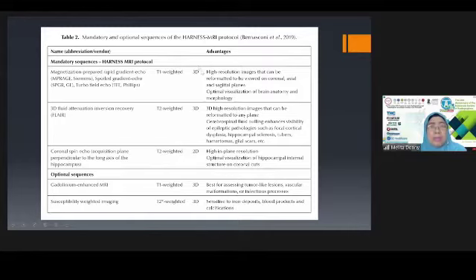Use T1 in 3D, yeah, to get the high resolution. Use T2 3D also, 3D FLAIR. I mean, can you use T2 in 2D, yeah, to look at the hippocampus, usually perpendicular to the temporal lobe, and also we can use contrast or susceptibility weighted imaging, or SWI.